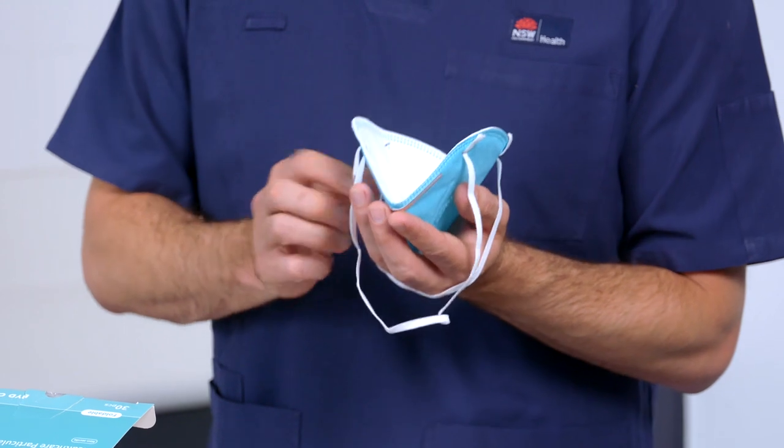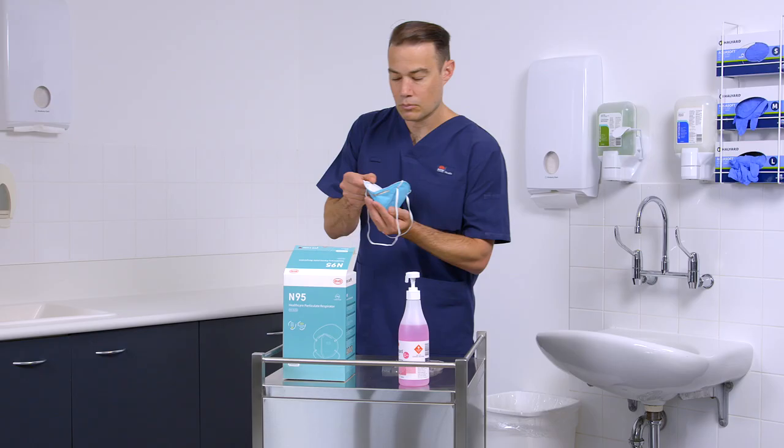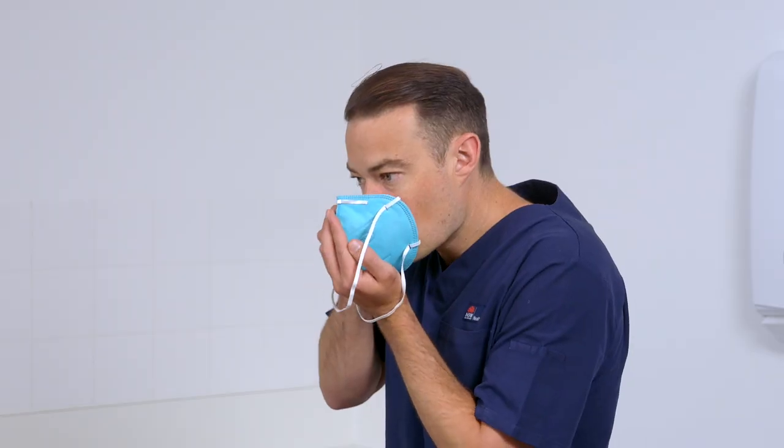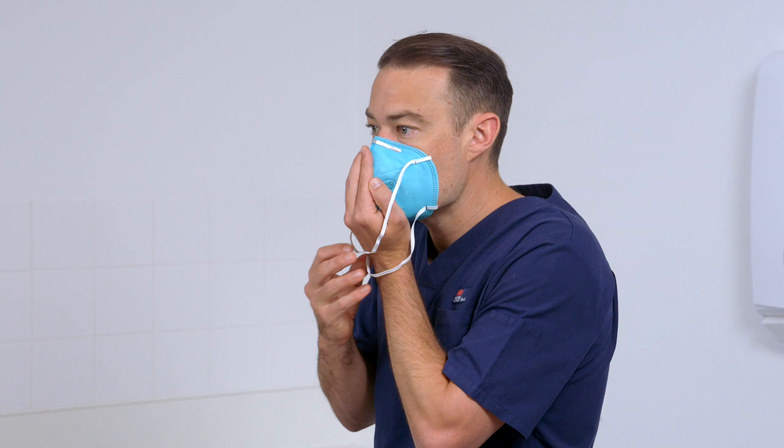Cup the respirator in one hand with fingertips positioned at the nosepiece. Place the respirator against your face. Position the respirator under the chin with the nosepiece across the bridge of your nose and mouth.